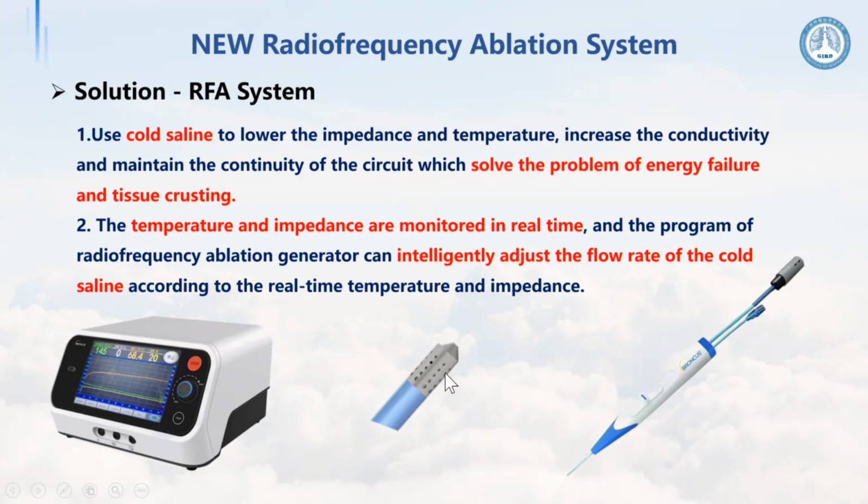There are many small pores through which saline can be infused, which cools the local temperature and lets the heat expand farther. A sensor here can also detect the temperature, and we then control the power.